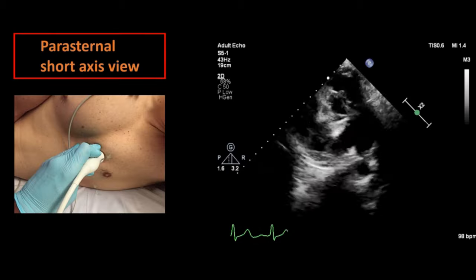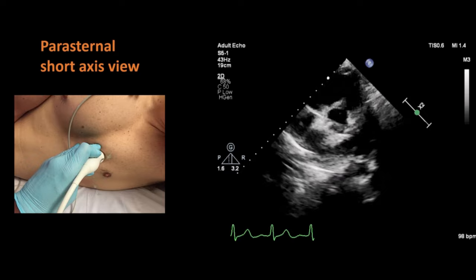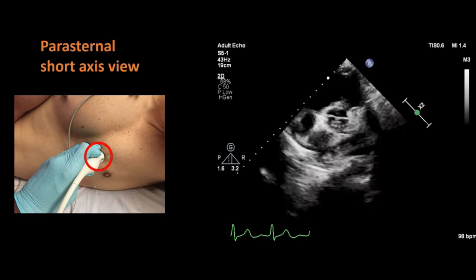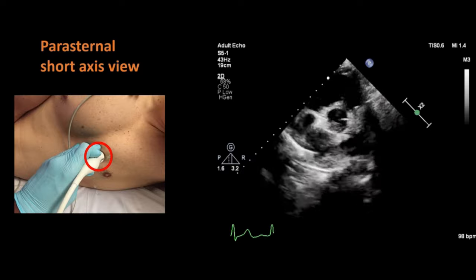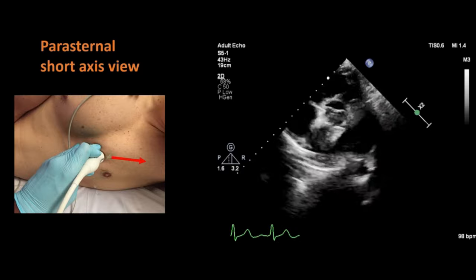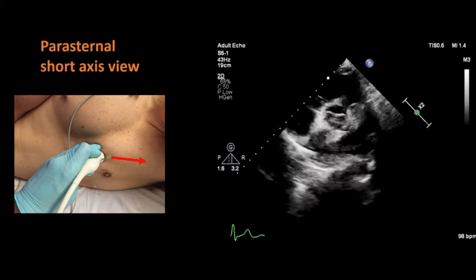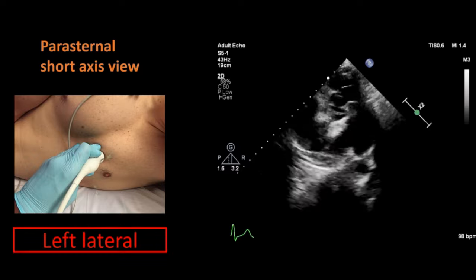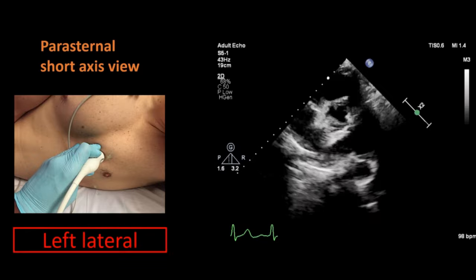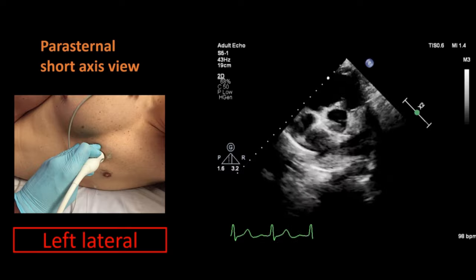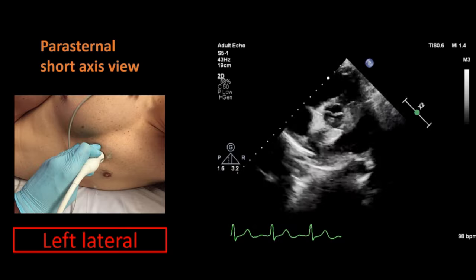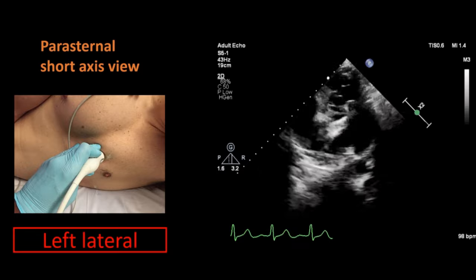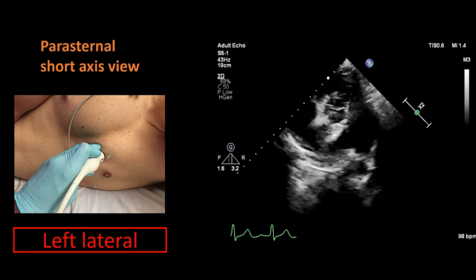By changing the direction of the probe towards the left shoulder of the patient, we get a short axis view of the heart. You can see that the probe is in the same third intercostal space, just lateral to the left sternal border, but now the orientation marker points towards the left shoulder of the patient. The short axis view is obtained at three different levels of the left ventricle: aortic valve level, papillary muscle level, and mitral valve level.